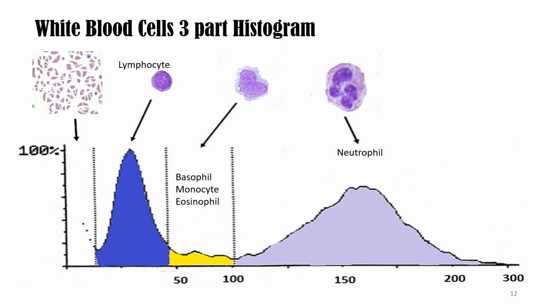Not only in America, but all over the world. Y así como tú ves aquí, en el conteo de glóbulos blancos, él no te mide los glóbulos blancos porque son segmentados o porque son de diferentes formas. No, lo mide por el tamaño, por el ancho. So, si el laboratorista no estaba contigo cuando se sacó la sangre, él no sabe si tú invertiste o tomaste la sangre apropiadamente. Por ende, la máquina, recuérdate, la máquina va a darle nombre de acuerdo al tamaño de esta célula. Y por eso hay tantos errores preanalíticos.